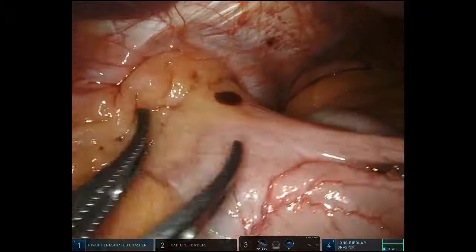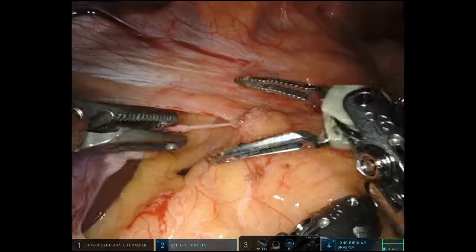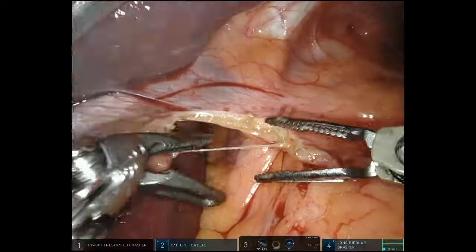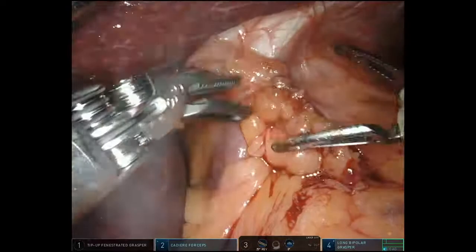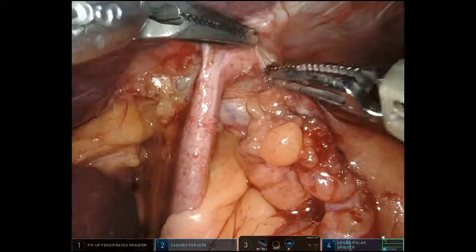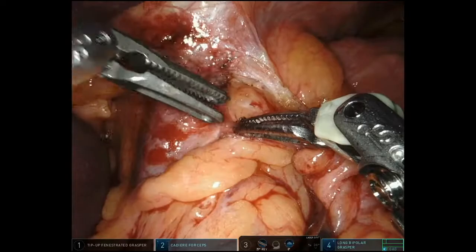The first thing I'm going to do is reduce the hernia with my fourth arm — not pulling so hard that I create a tear on the serosa of the stomach, just gently reducing it while getting through the gastro-hepatic omentum with bipolar cautery. Sometimes you'll see a replaced left hepatic artery here; if it's a big branch I'll preserve it, but if it's small I'll buzz through with bipolar. What I'm trying to do is dissect out the right crus of the diaphragm, getting into that space between the muscle of the right crus and the hernia sac.